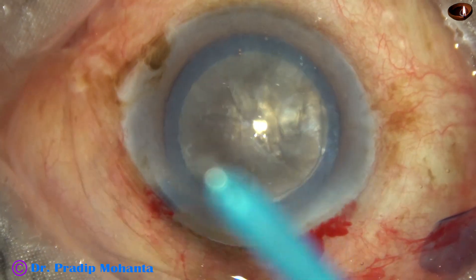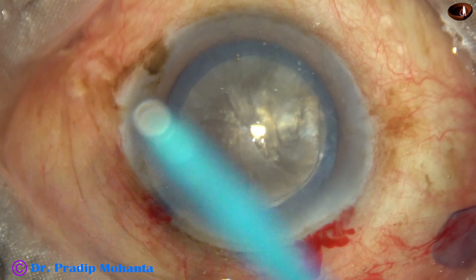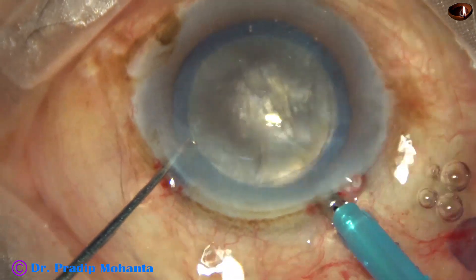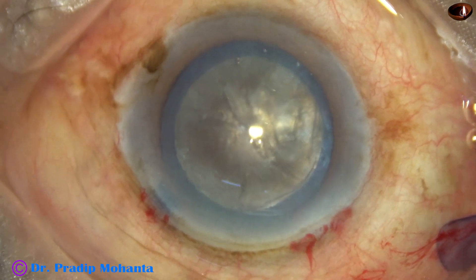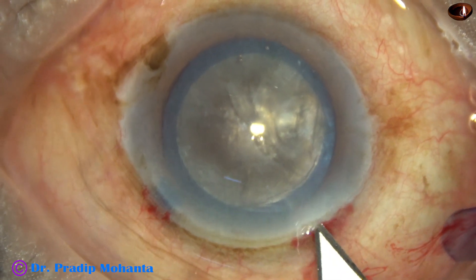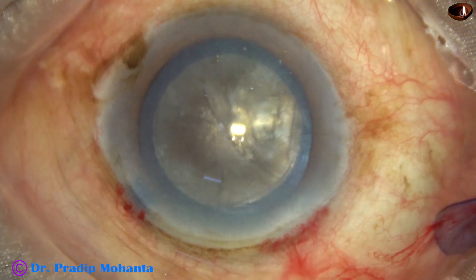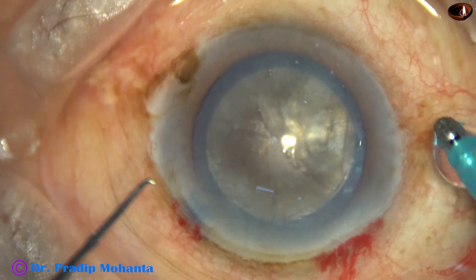And now is the time to introduce the phaco needle. The exposed part of the phaco needle is a little more than in other routine cataracts where the nuclear sclerosis is grade 3 or grade 2. The main wound was small and it was difficult to introduce the tip, so I enlarge the main wound a bit.